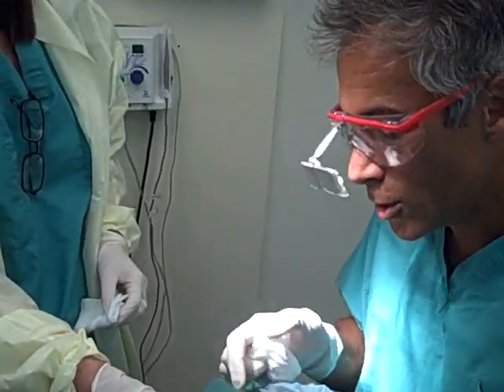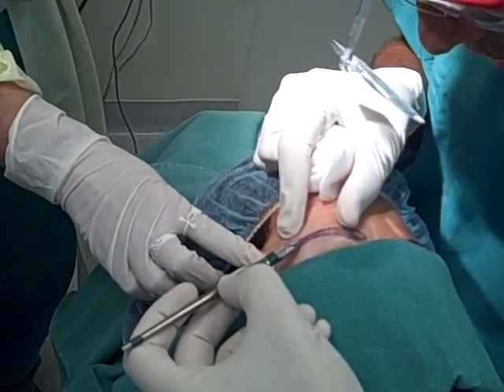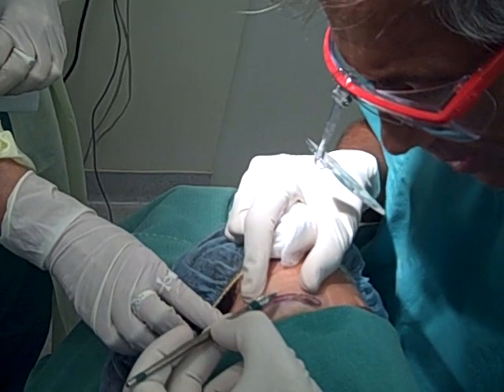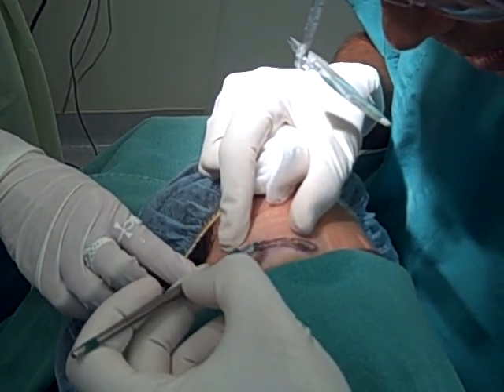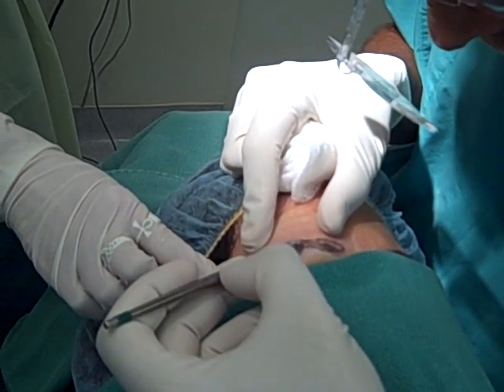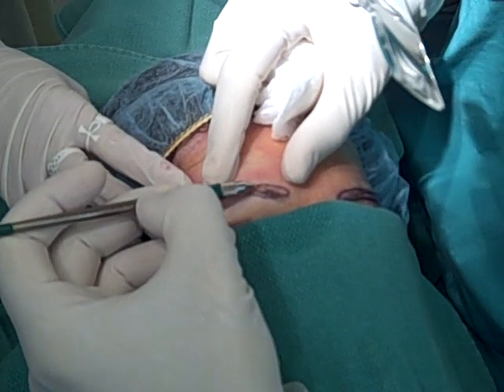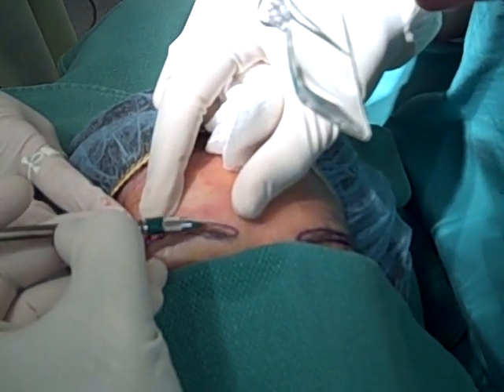And what I will typically do in one of these procedures is as many as 325 to 350 recipient sites into each eyebrow, thus producing the most impressive and of course natural looking results. And you can see I'm making the recipient site, and as I said, into each recipient site is going to go a graft which has 1 or 2 hairs. And here the direction changes and it goes more in a vertical direction as opposed to a down growing direction. So I'm following the natural direction using these very tiny recipient sites.